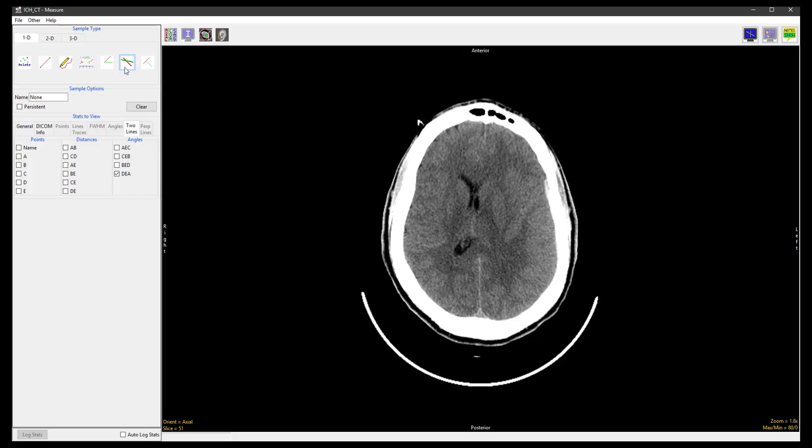In the Stats to View panel, any of the points, distances, and angles can be selected for the lines AB and CD that we will define on the image, with point E being the point at which the two lines cross.